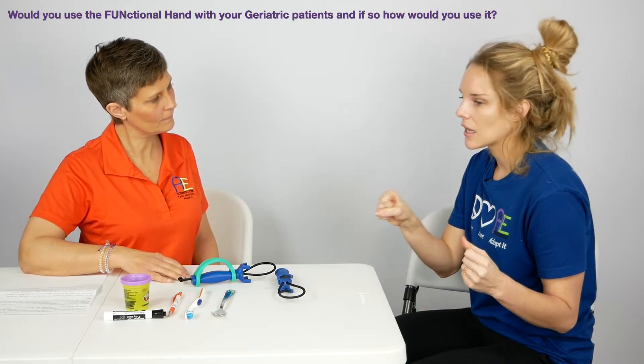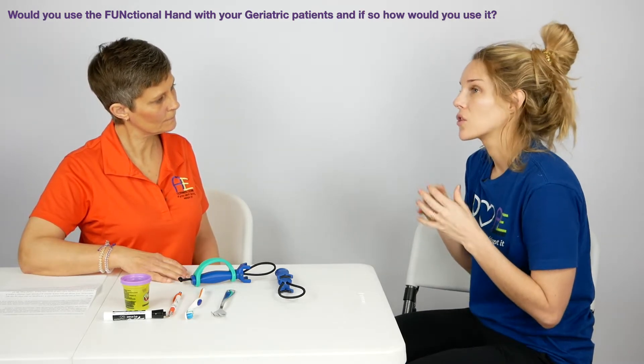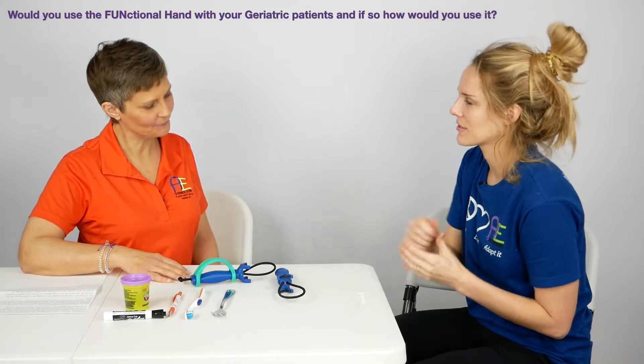Whether that's feeding, eating, brushing their teeth, brushing their hair, or more of those higher level things like cooking and cleaning — anything that you grab onto with your hand, you can use the Functional Hand with.